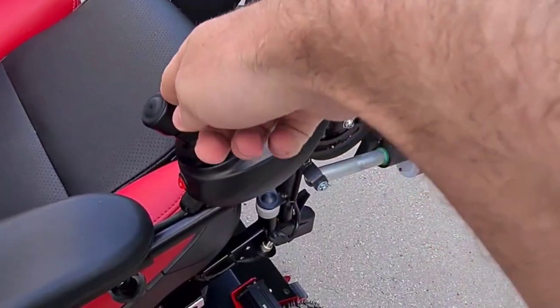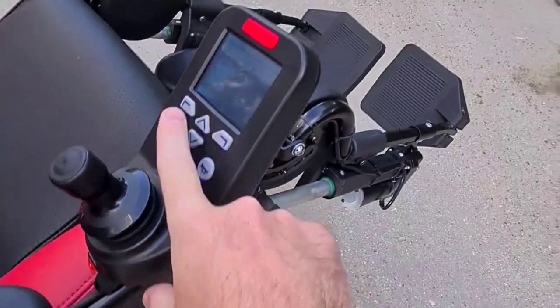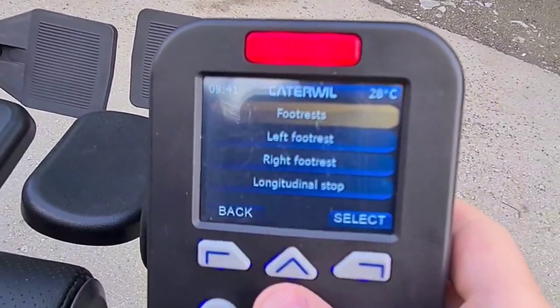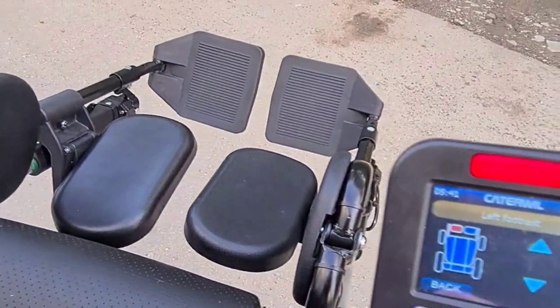Also can be controlled by joystick or by buttons — two legs together, or each leg separately.